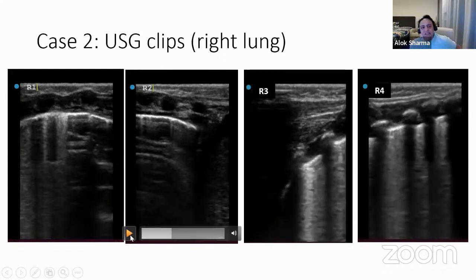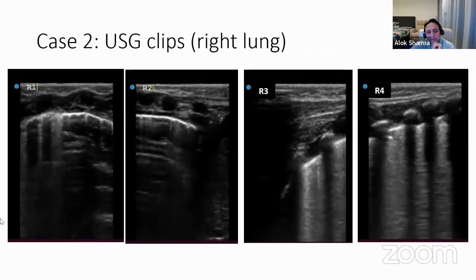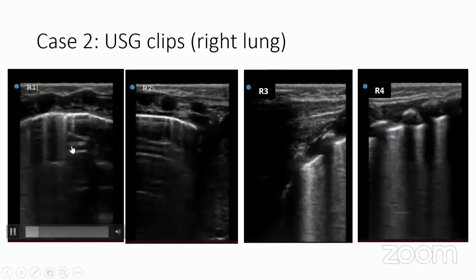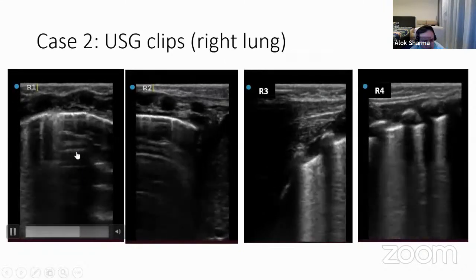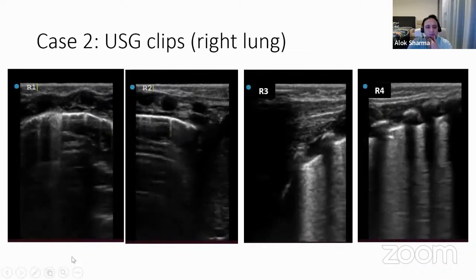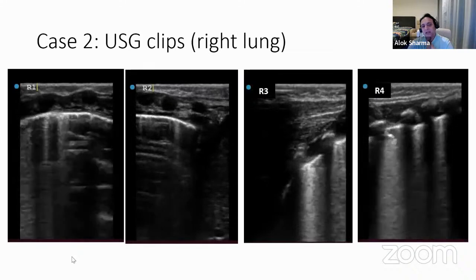So what you're classically seeing from R1 to R4 is just classical lung transition. Now, clearly from our perspective, when you look at R1, you've got the upper half of the lung field being B dominant, and the lower half of the lung field having A lines. Yes. So this basically is a double lung point. Classically, it's a marker of transitioning lung. The reason I would not call this transient tachypnea of the newborn is because of the history that you've given me. Some babies who've had therapeutic hypothermia can have an element of wetness because they have interstitial edema secondary to surfactant inactivation.